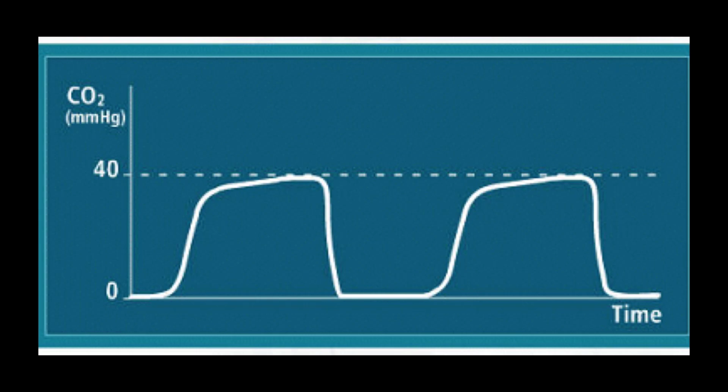It's important to recognize the possibility of a false positive colorimetric change, and you need to see that colorimetric change be persistent beyond 8 to 10 breaths to be confident that you're in the glottic structures.